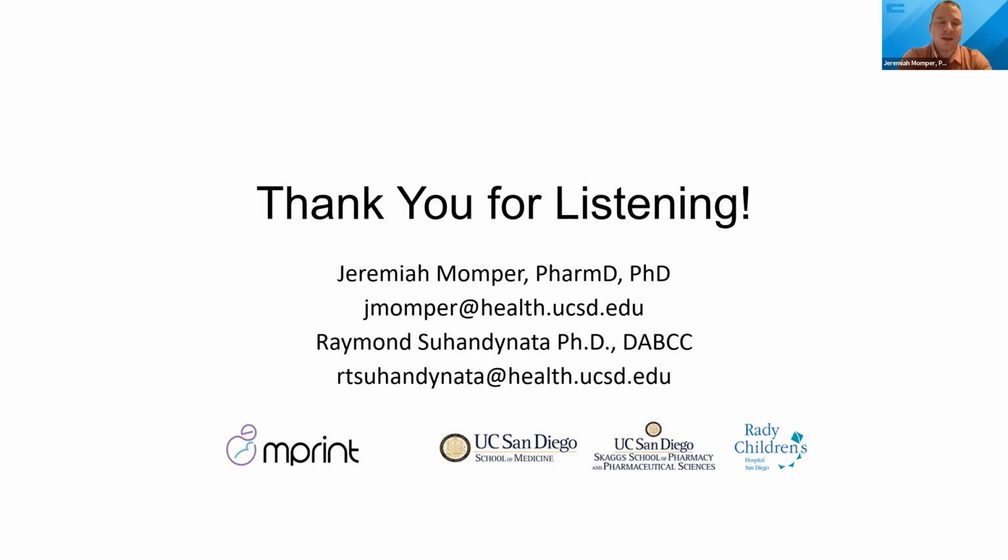Ray can speak a little bit more about our capabilities with large molecules. We do have the instrumentation to do that work, but haven't done a lot of projects so far. So Ray, what would you like to add? Right. I think that's probably going to have to be done on more of an inquiry basis. Probably the easiest one to do is a biologic like a monoclonal, because those types of analyses can at least be standardized, and typically they are done by digesting the monoclonal antibody and monitoring peptides that are specific to it.